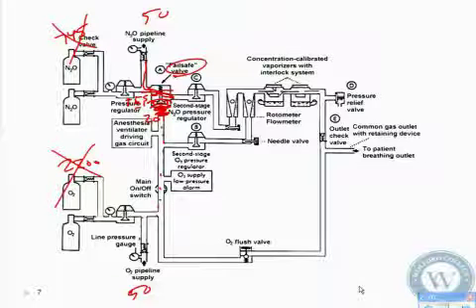We're sticking with 20 for the PSI. It has to be greater than 20 to allow nitrous to flow. It has to be, according to that one paper, less than 30 before the alarm will sound. Okay? But we're going for 20 for the pressure. It has to be at a 20 pressure or greater for nitrous to flow.